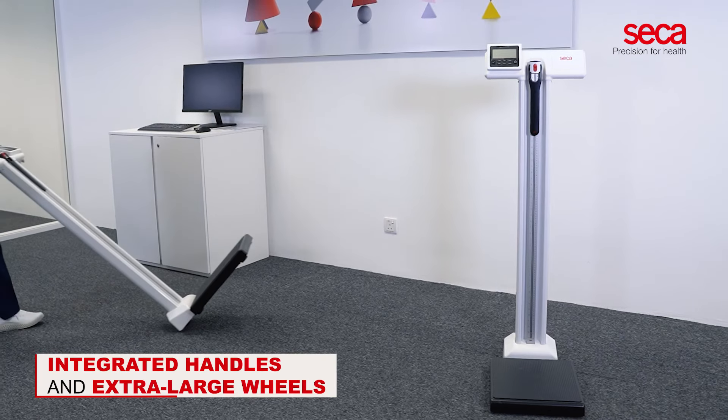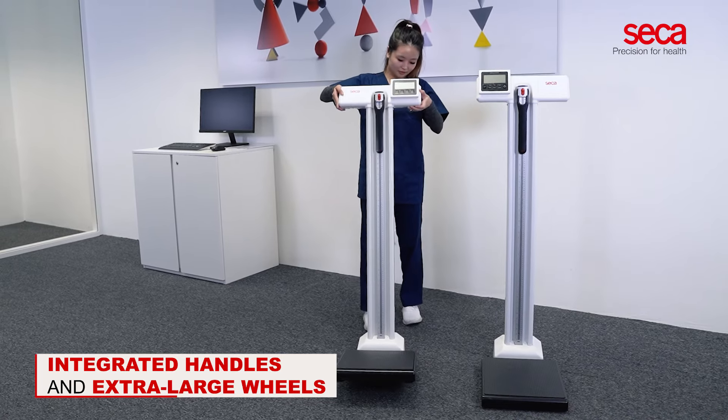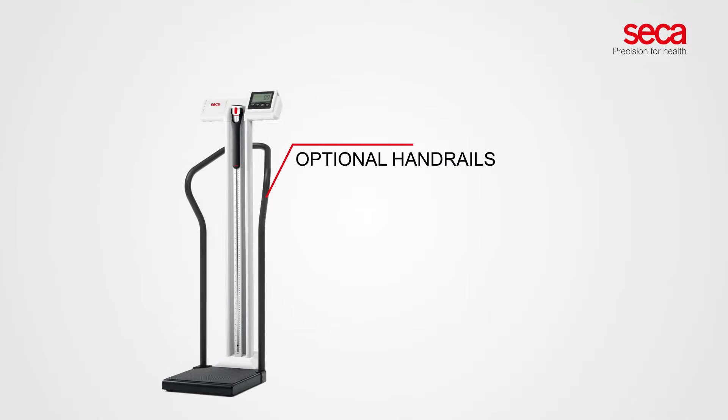Integrated handles and extra-large wheels make CECA 777 and CECA 787 easy to maneuver within healthcare facilities. Both scales can be equipped with optional handrails that provide extra support and stability for patients in need of assistance.